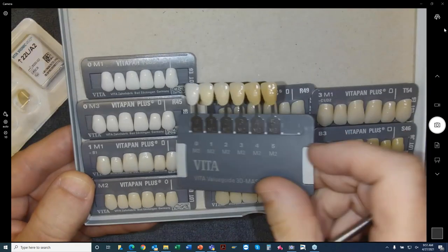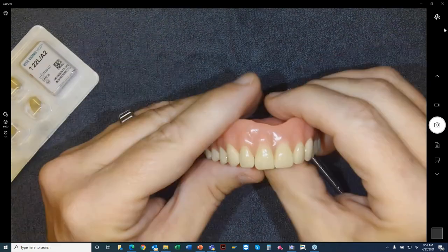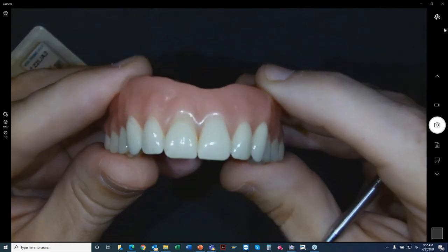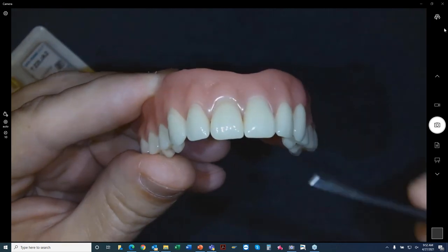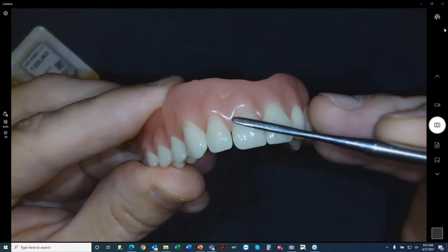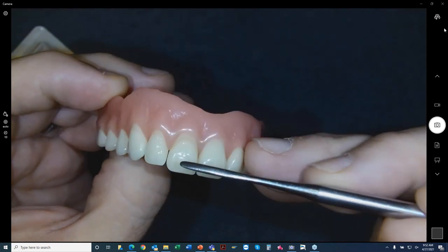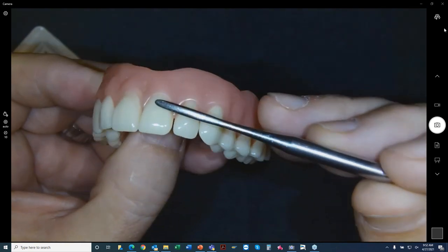We also have, let's say that texture is too much. So we have a denture here that, let's say that you selected the Excel, and the Excel teeth were a little bit more texture than needed. And you can watch a video on this. Paul, my colleague, did a nice video showing you how to do this. Just a couple seconds, you can move these textured teeth right to a nice polish.